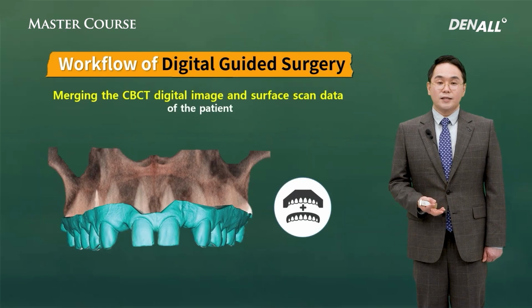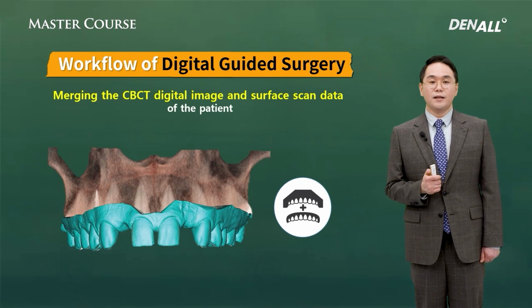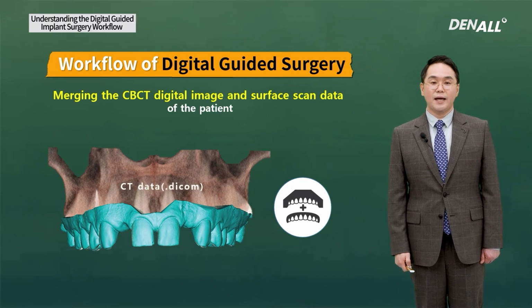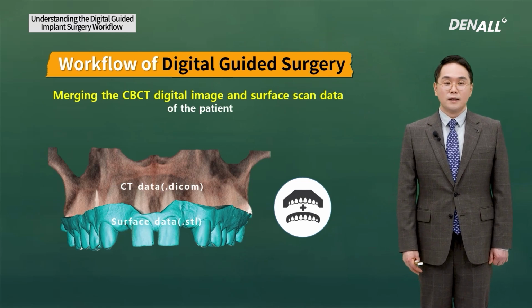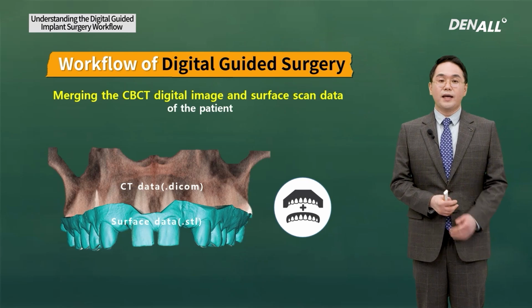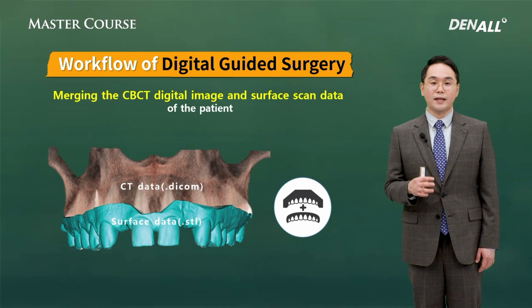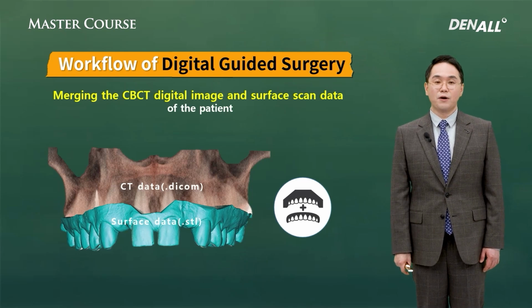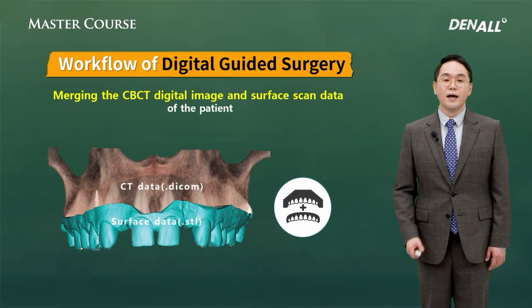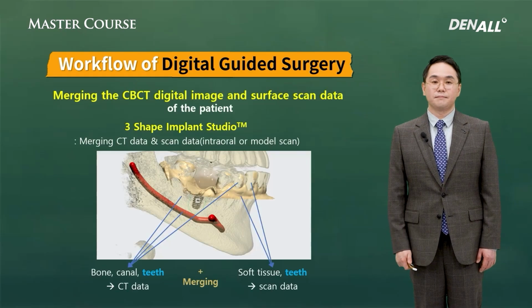So, the DICOM file from CT and the three-dimensional STL file from the intraoral scanner should be merged together. Before planning, this is the most critical part, which is merging. The CBCT DICOM file and the surface STL file need to be merged. This is the merging procedure. The merging is done based on teeth.